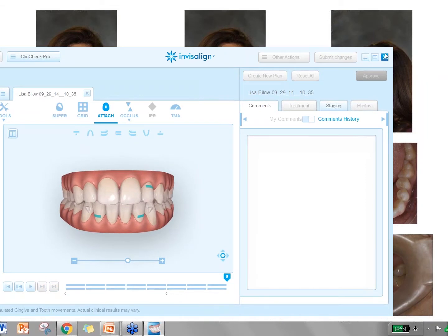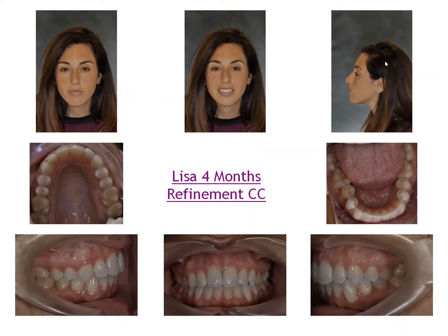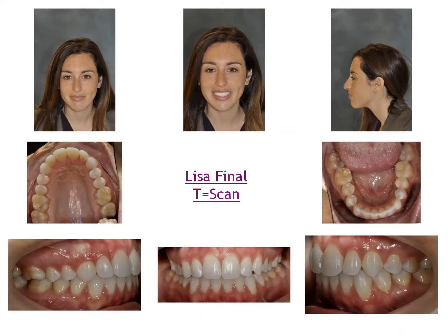8 aligners at less than a week apiece for her, and we were able to go ahead and take her to this finish. I'll skip the T-scan again, but you can see we end up with a nice, beautiful result. Actually, I will show you this T-scan. I'll skip them in the future.